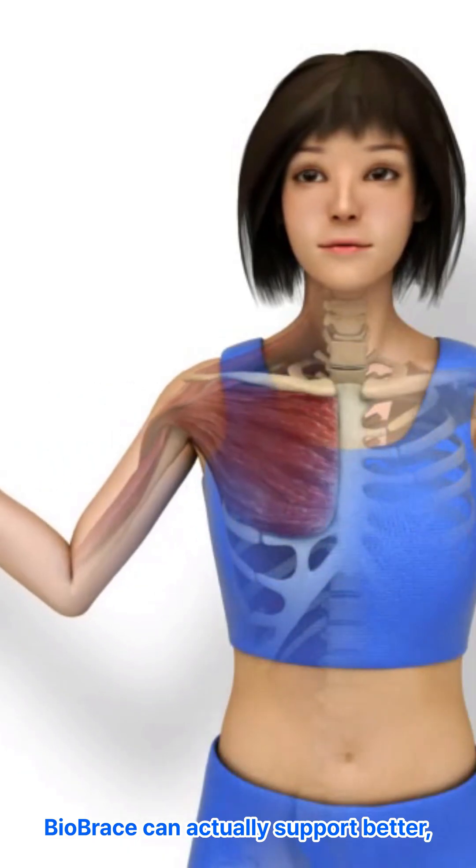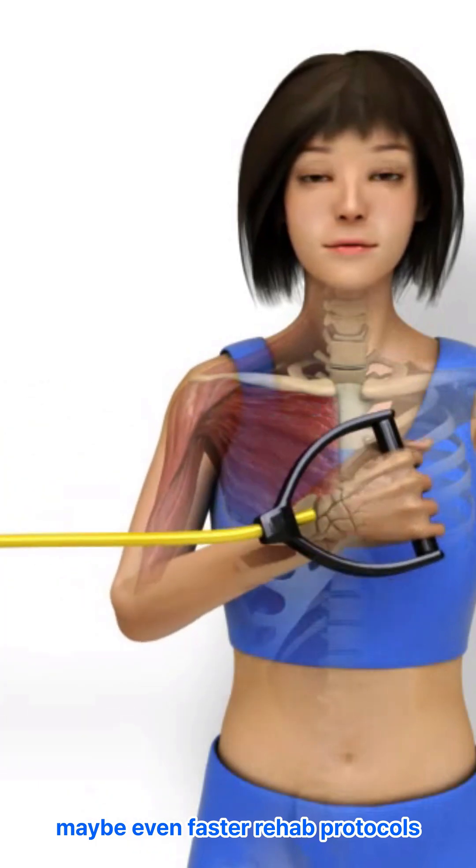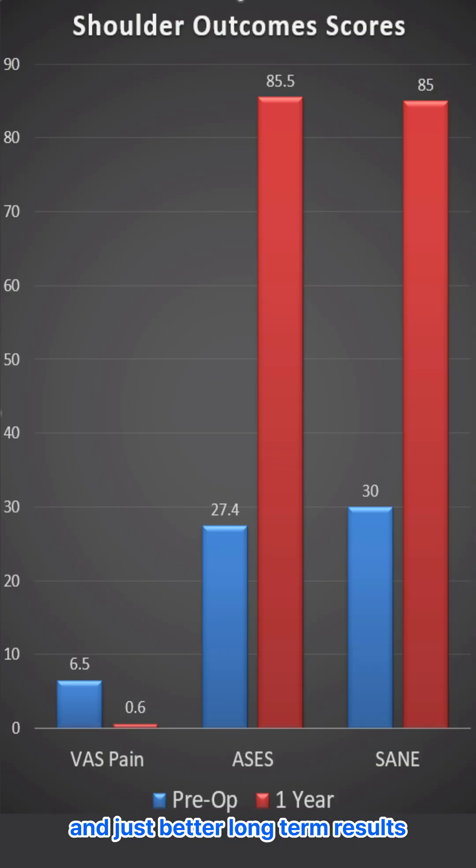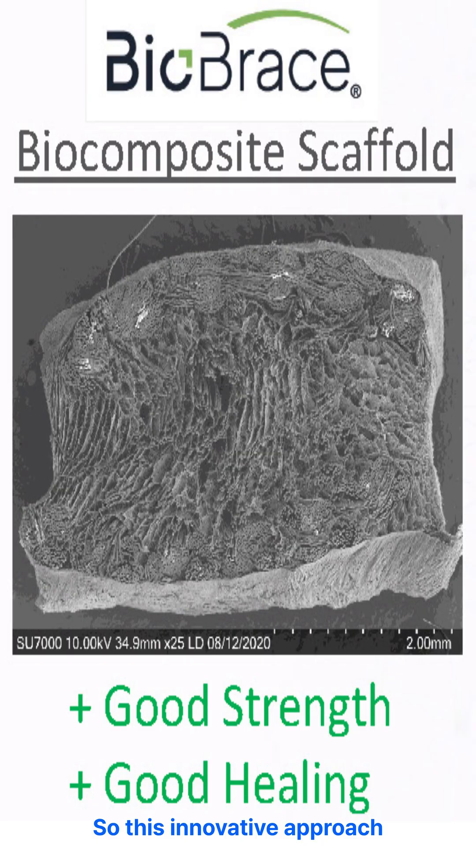BioBrace can actually support better, maybe even faster rehab protocols. That potentially means fewer failures and better long-term results for patients. This innovative approach really aims to optimize healing, offering both strength and biology right from day one for potentially better outcomes.